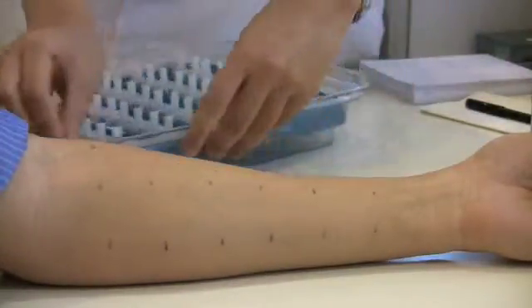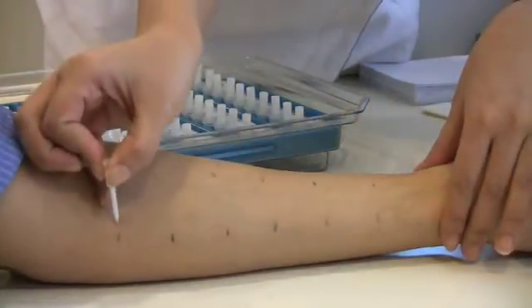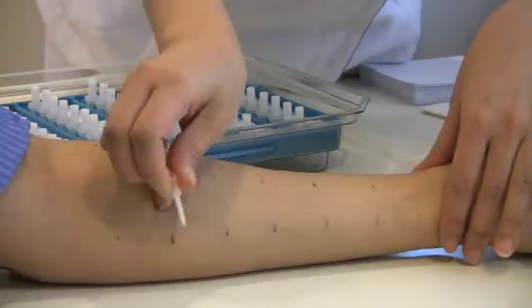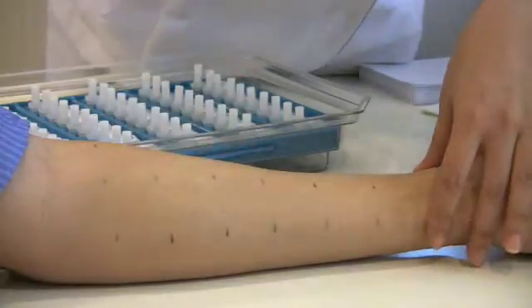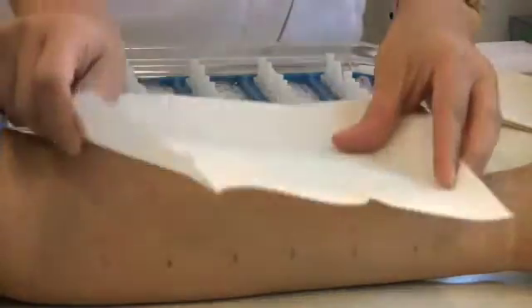In this case, we will be performing the 18-allergen environmental panel. The picks are used to make small scratches in each position to allow the extracts to penetrate into the surface of the skin. The extracts are then blotted away.